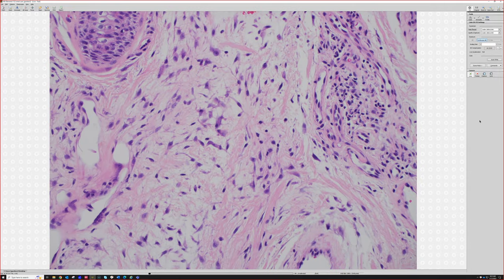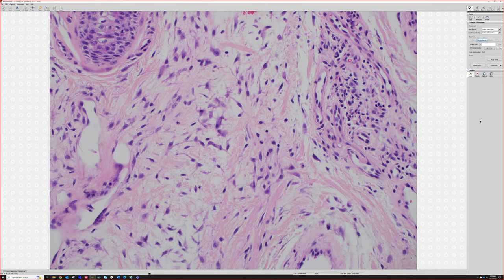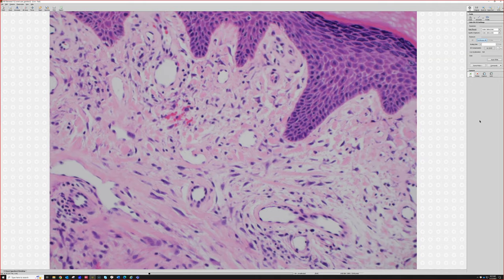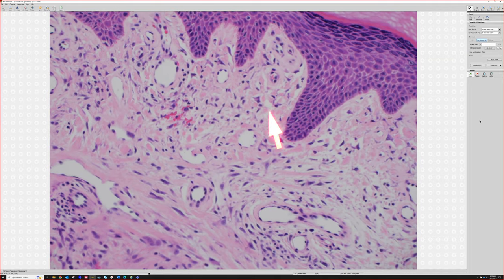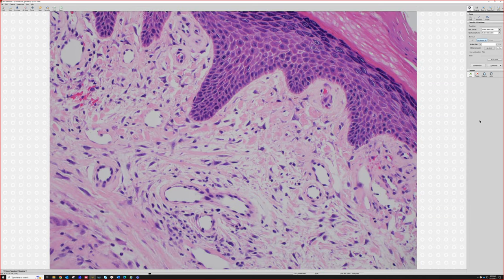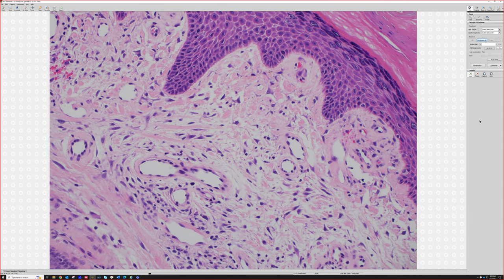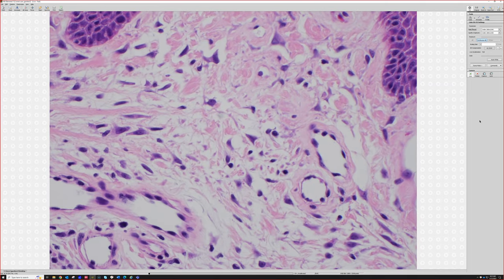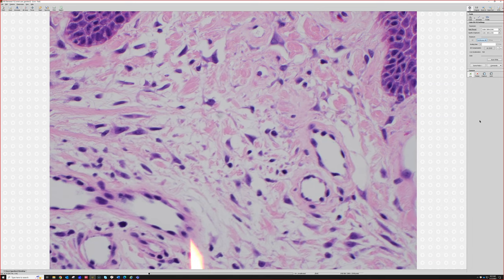So here we've got some kind of stellate, star-shaped, triangle-shaped cells that look like reactive myofibroblasts almost. In the more sclerotic areas, this is more typical, these spindled or stellate, spiky-looking cells, sometimes with binucleation or trinucleation. And my program director for fellowship, Doug Parker, said that these reminded him of the little insignia on the Star Trek uniforms in The Next Generation. It's a little swooped thing right there. So that's kind of nice.